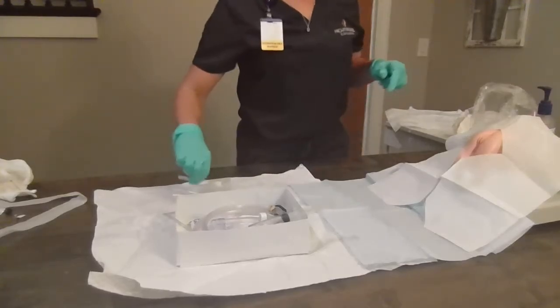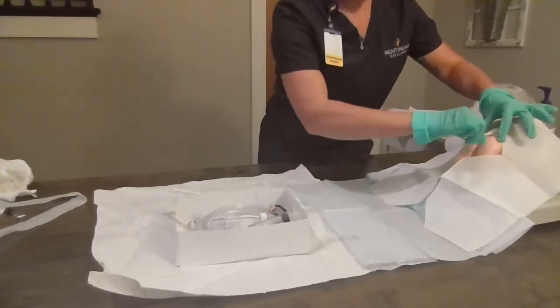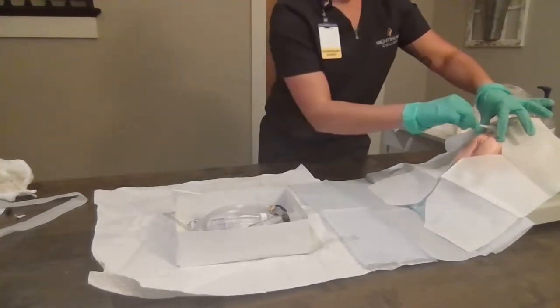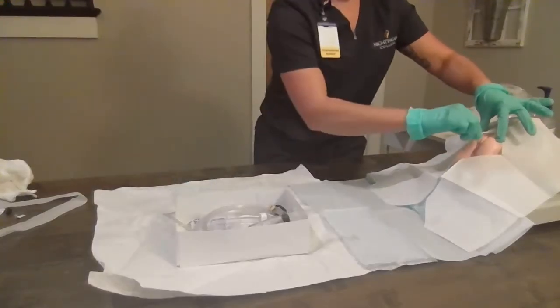Ms. Smith, we're going to start by cleaning. You're going to feel my hand one more time. We're going to swab with the cleaning swab — anterior to posterior from the far side, anterior to posterior on the near side, and right down the center.